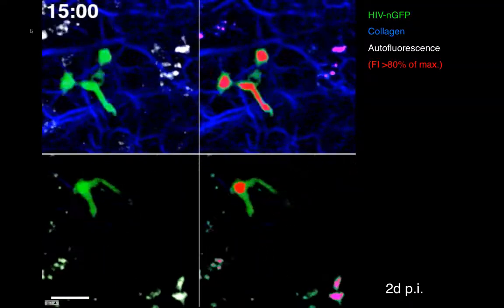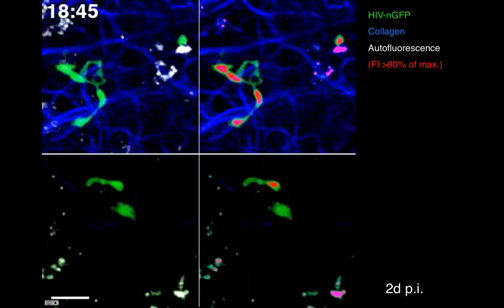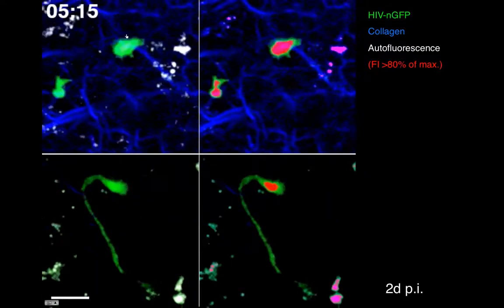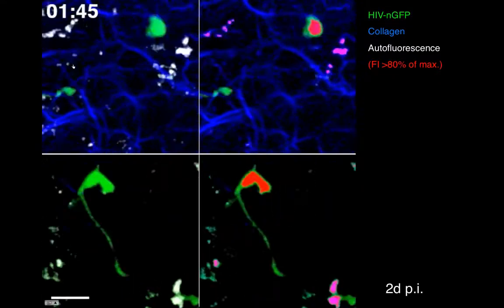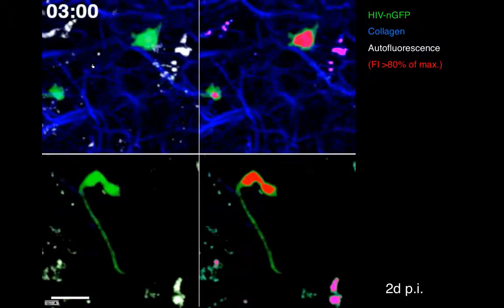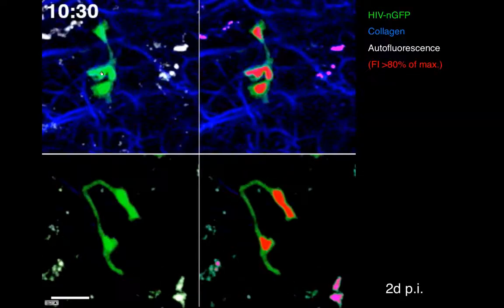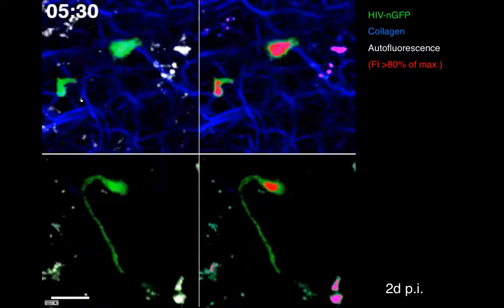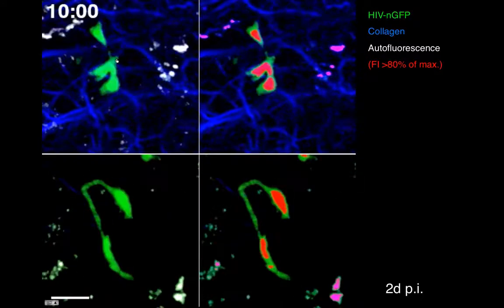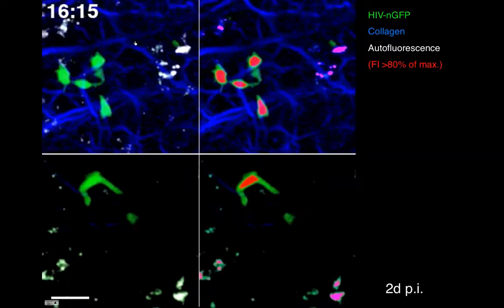So here, if you just look at the top left, that's the original recording of one of these movies. You see that there's this cluster which comes in onto the top right, and then all of a sudden disperses. And you can actually see these bright zones here, which are the actual nuclei with the highest expression of GFP, and there's 4, or actually I think 5 in this case, discernible individual nuclei that become visible as soon as this cluster disperses. Once it looks like one big cell blob, and then it disperses.